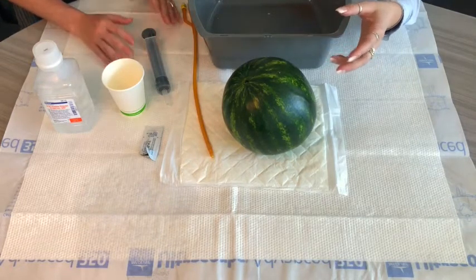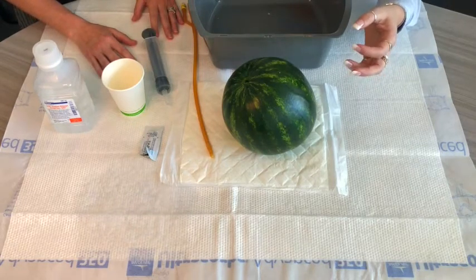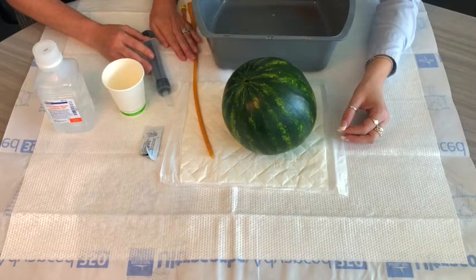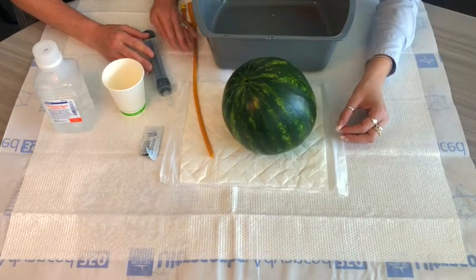Next you'll want to clean up anything that's dirty that you've used. Discard anything that you don't need to reuse again. Save your catheter and your syringe and wash those out with soap and water and let them air dry. Then wash your hands again.